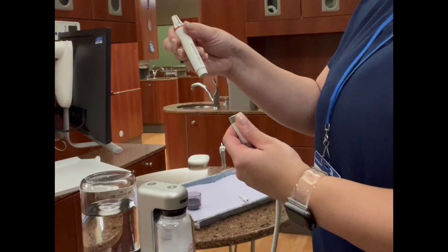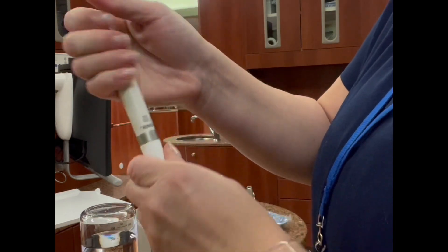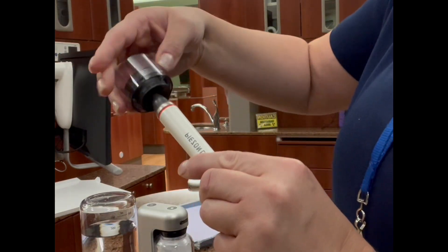To connect the piezo handpiece, match up the connectors with the holes on the hose and press down. Next, screw on the tip until tight.